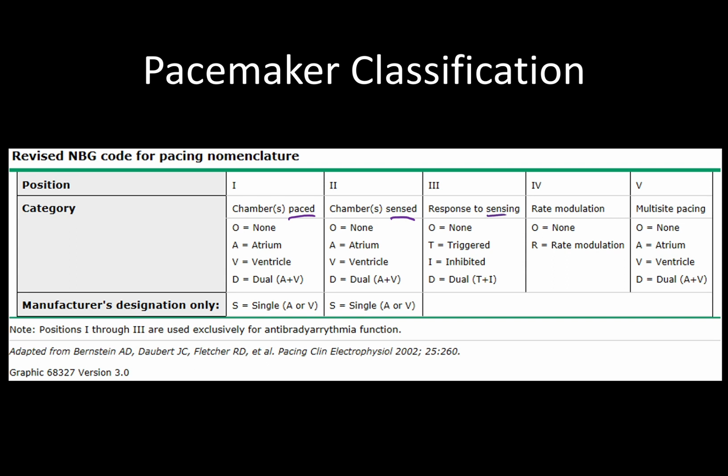And those are really, really cool things. The short version is that pacemakers nowadays are very smart. In fact, they're smarter than your phone. And way more reliable, by the way. Because let's be honest, if your life is dependent on this pacemaker functioning, you can't have it glitch out or anything like that. Really cool things that a pacemaker can do include the mode switching.